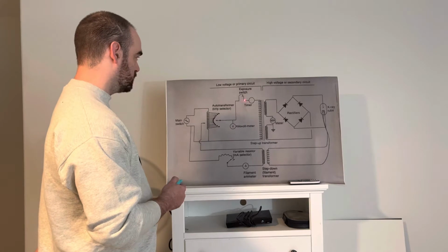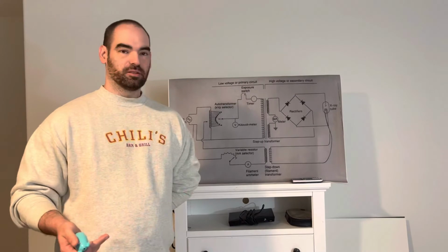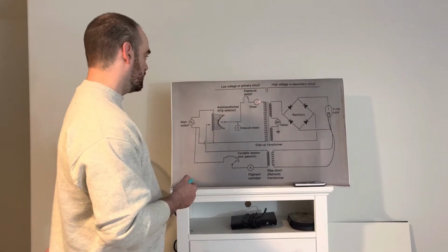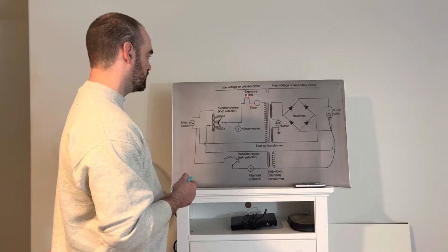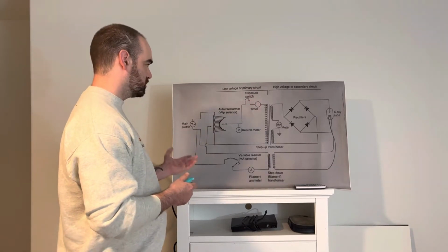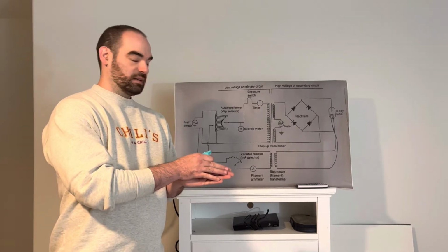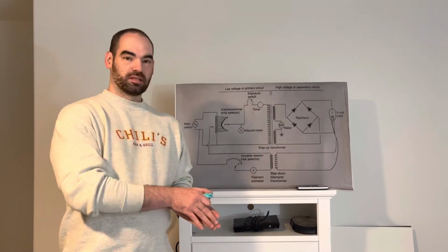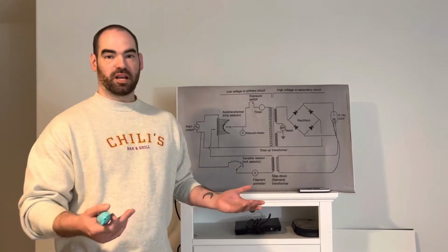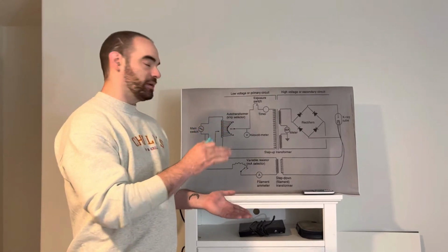After that, we'll go over to the exposure switch and the timer. The technologist will select a time, we'll say 3 seconds, and the timer will affect the exposure switch. The exposure switch will act like a drawbridge, and once it closes, that will close the circuit to make it work, and it will close for exactly however much time we set, say 3 seconds. After exactly 3 seconds, it will open back up to stop the loop.